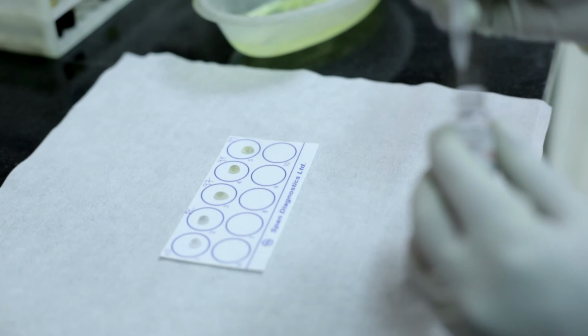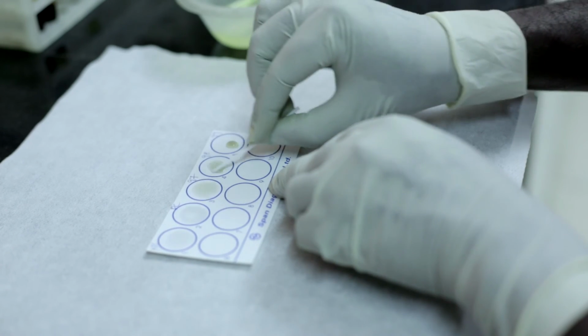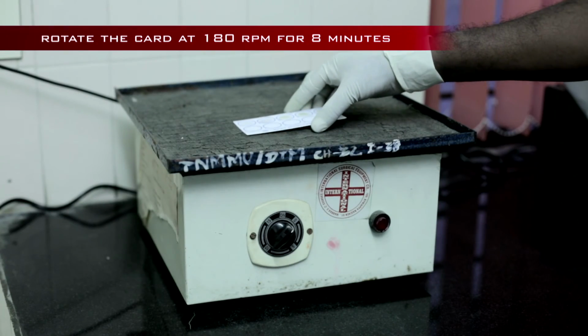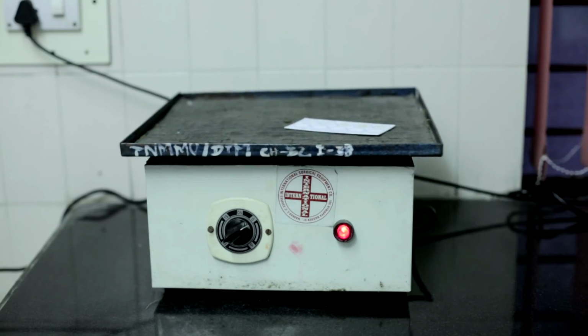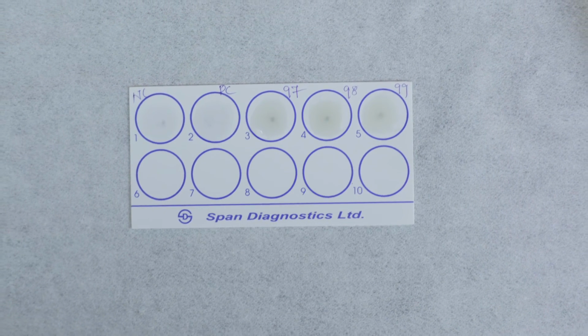Take care not to touch the liquid with the dropper tip. Mix using the stick. Then, rotate the card at 180 rpm for 8 minutes in the VDRL rotator. Examine the card for floccule formation to interpret the results.